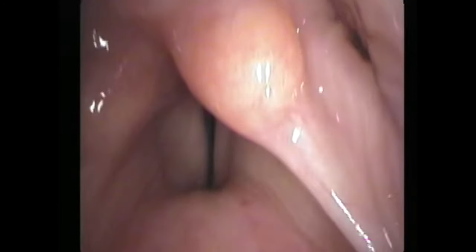I'd like to talk about this case study of a woman with one year of hoarseness. She does say that about two years ago she was in the hospital for a heart problem but did not have a tube in her throat. This is an instructive case because when we focus on the vocal processes, we're going to be looking for the difference between translation and rotation, and it's that difference that's going to help us avoid confusion about what to do with this patient.